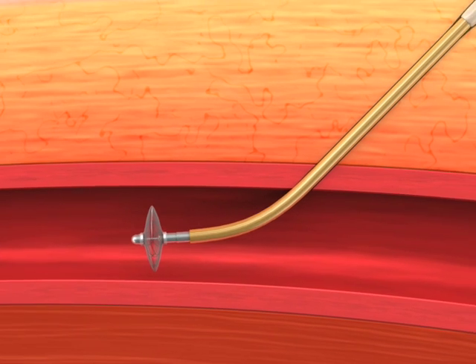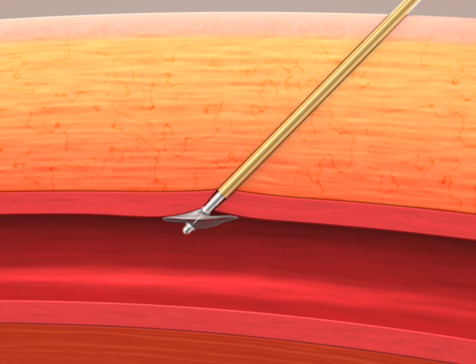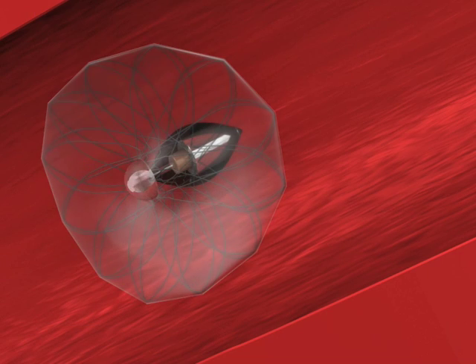As the sheath is removed, the catalyst disc will track and seat at the arteriotomy opening. Applying upward tension to the wire secures the catalyst wire disc firmly against the intima, providing temporary hemostasis.